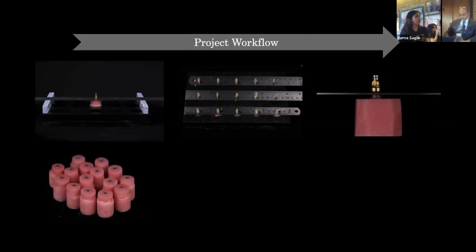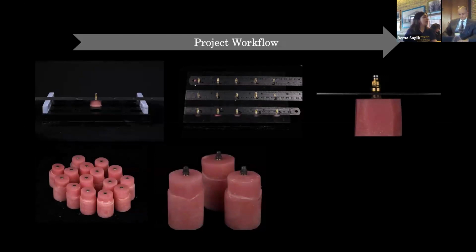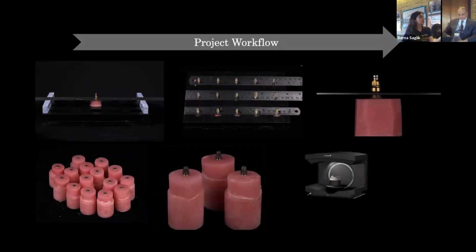Now, we did this for all the copings over here, and this is a zoom in of the platform of the implant. You can see there almost 1 millimeter, and we make sure that our mounting is completely parallel, or perpendicular to the floor. So this is what we had over here. We had all of them, we wanted good length over here. And then we attached our tie bases and sandblasted those. We wanted to mimic the screw-retained situation, so we didn't torque yet over here.